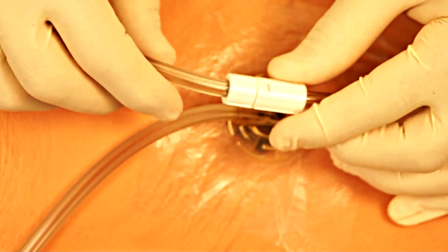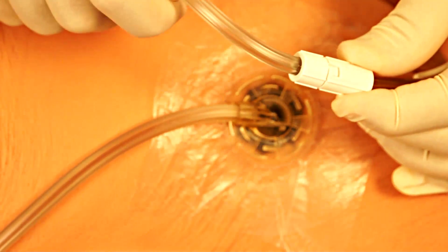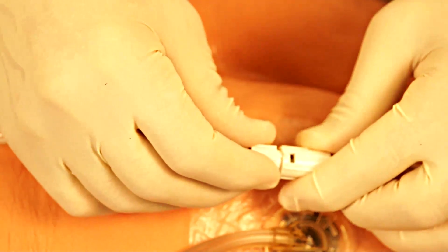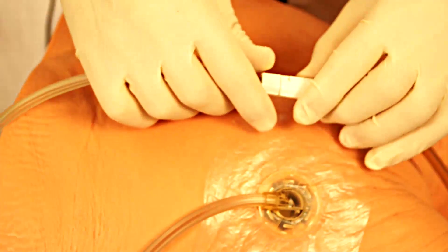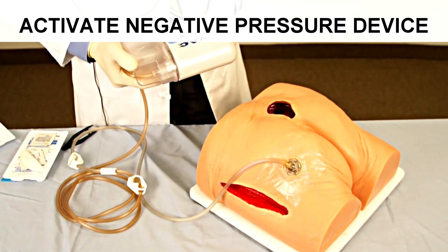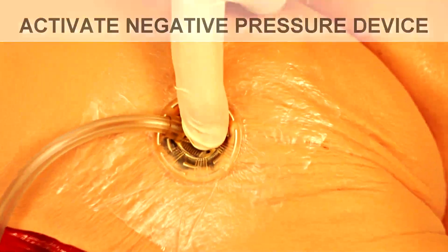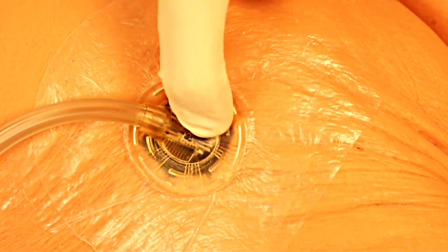It is important that when disconnecting the generating device from the patient, one would close off the patient side before disconnecting. This prevents outside air from being sucked back into the wound through the tubing. Once continuous negative pressure has been created by the generator, you will see the suction tubing adhere more closely to the wound.